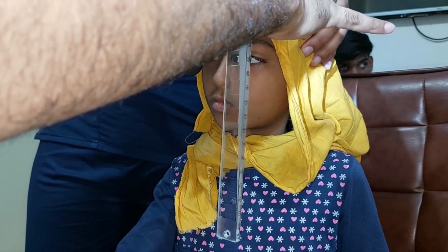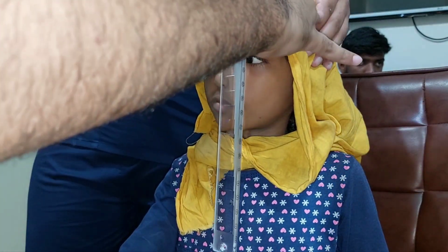So you keep on... This left eye is remaining an inward constant. So please perform the prism and the alternate cover test.